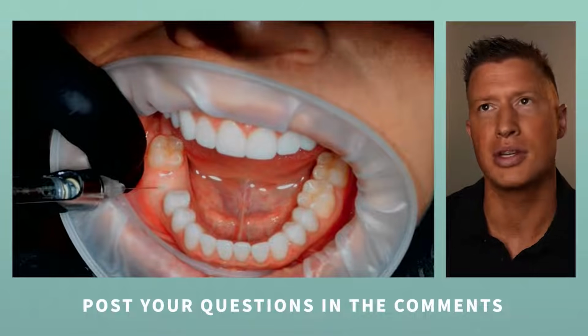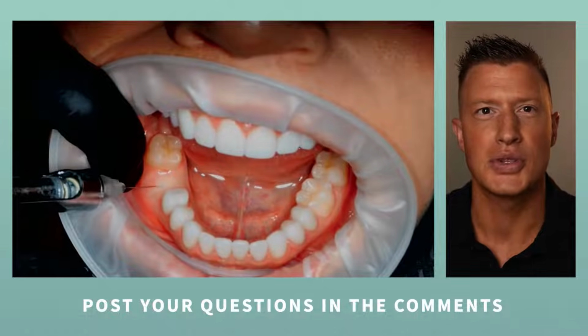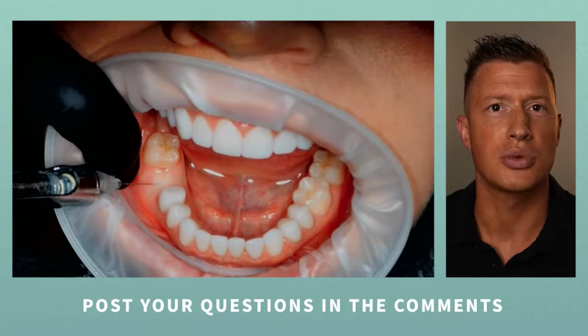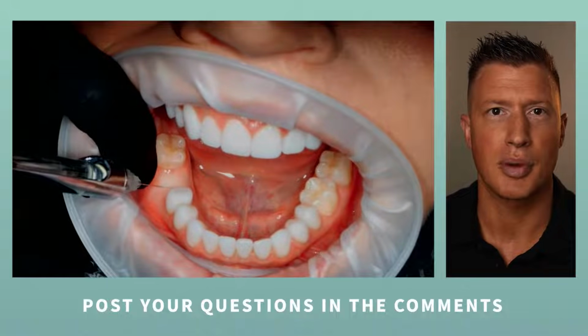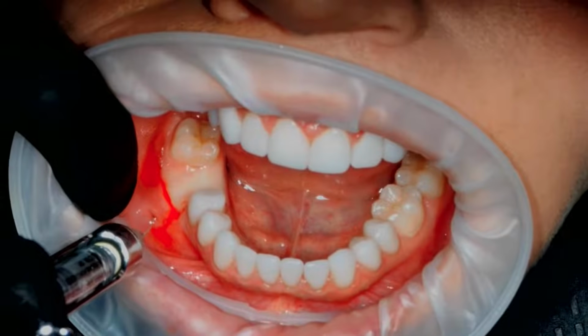That way we don't have a patient that's numb for hours. My wife particularly hates being numb, and so for her, she didn't have to have this droopy lip and be numb for hours. So we just gave some anesthetic right there on top of the gums. You'll notice just a couple of little spots, really hardly any bleeding there. You'll notice the site there is really bulky.